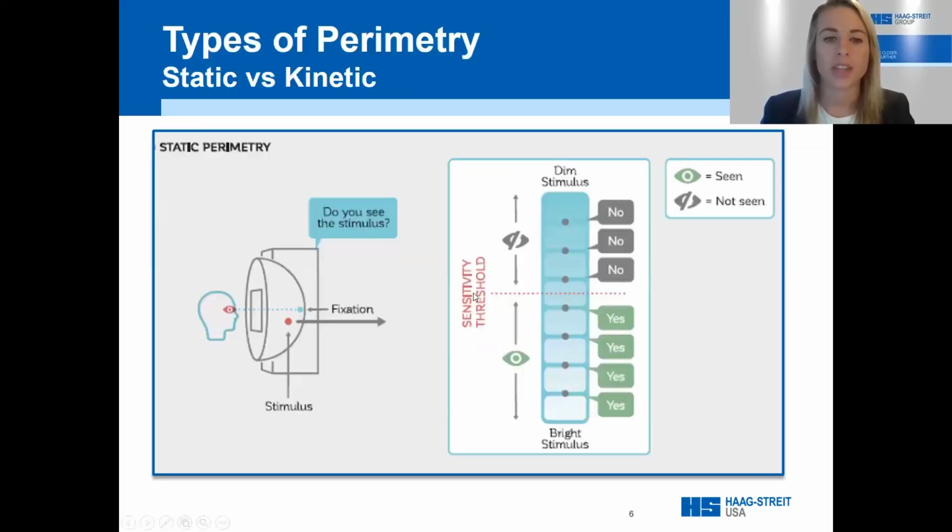There are two main types of perimetry, static or kinetic. Automated static perimetry uses stimuli of varying luminance levels to determine visual sensitivity thresholds at a specific number of fixed locations. We are looking for the decibel of light the patient goes from seeing to non-seeing. This is also known as a threshold. The results at each data point are then compared to normal values for a group of people of the same age. This method can detect small changes in sensitivity thresholds with relatively high accuracy.